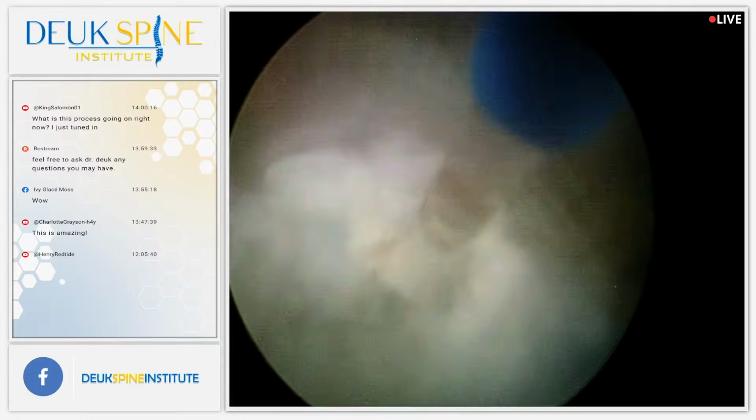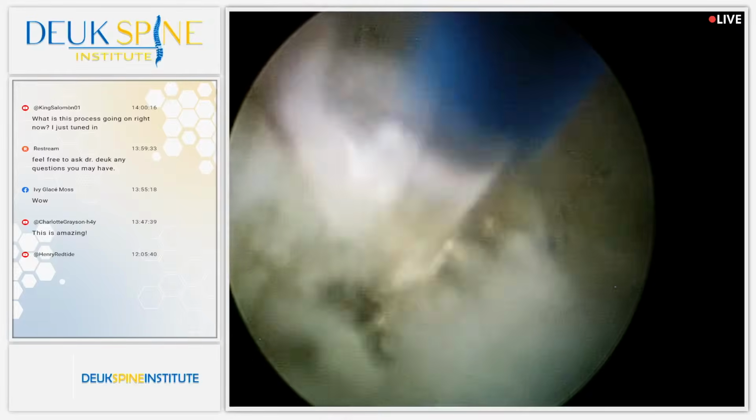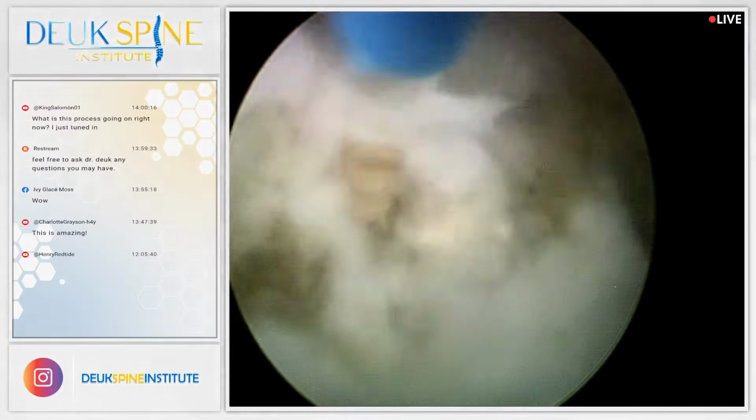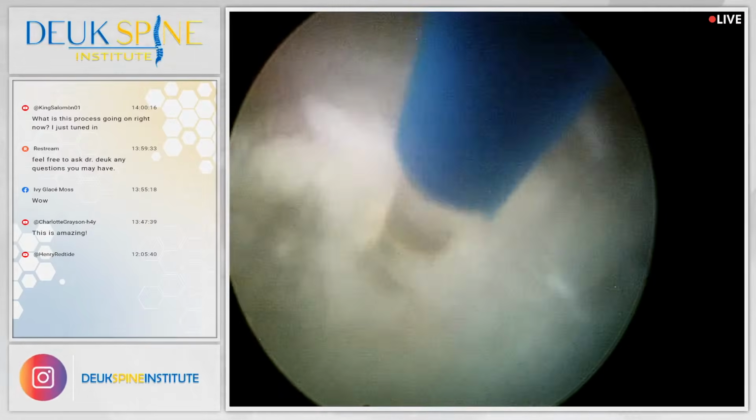All right, I understand we do have a question from our audience. Let's take the question. Yes, we have a question from King Solomon on YouTube. King Solomon. Very nice. Welcome. What is this process going on right now?